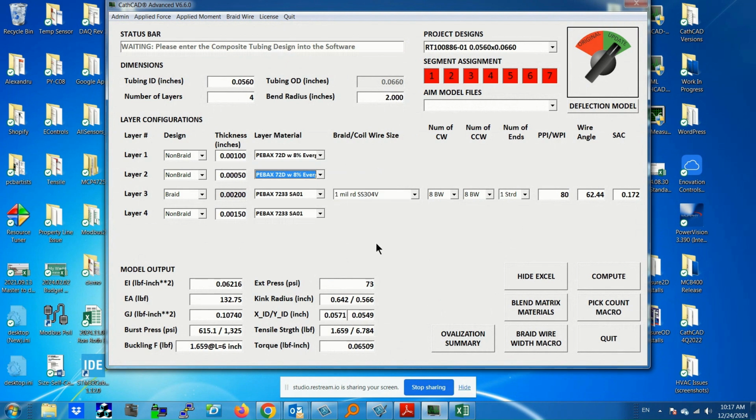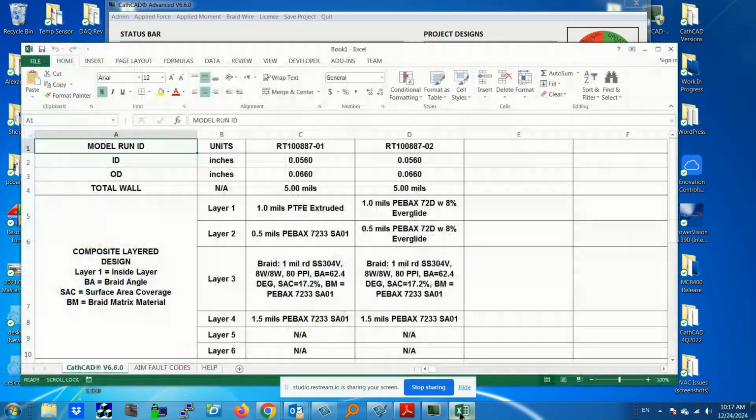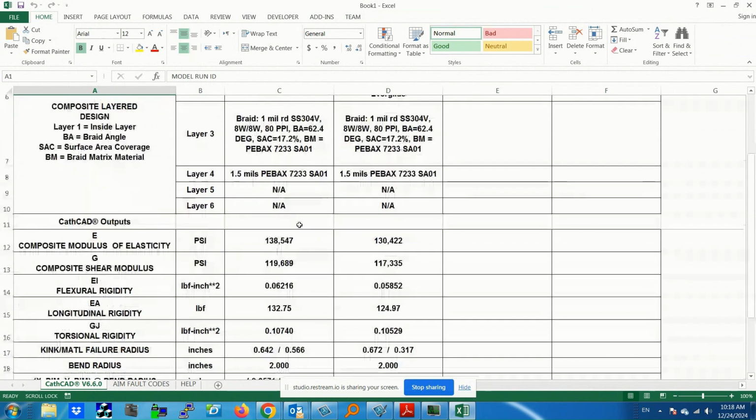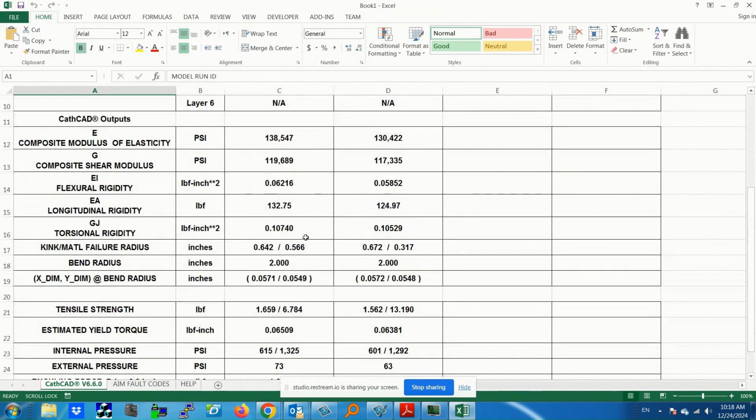So again, new design is in. I'm going to hit the compute button, and there you go. And we export that to Excel. And I've got my 2 models. Wow. Side by side. And CathCAD automatically assigns a tracking number to the thing so we can keep track of things. Basically, we've got our designs up here, and now we can look numerically at the difference between the 2 designs.